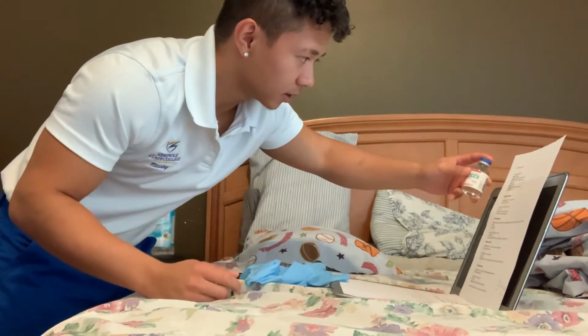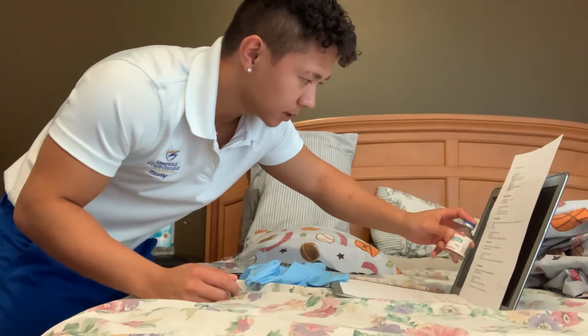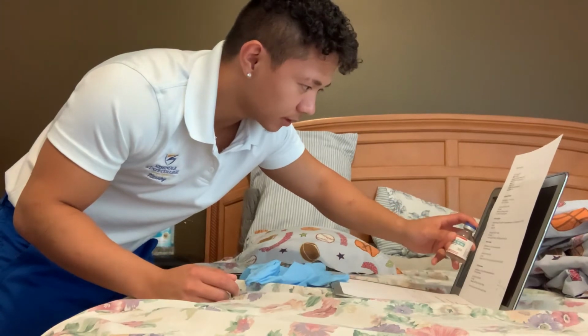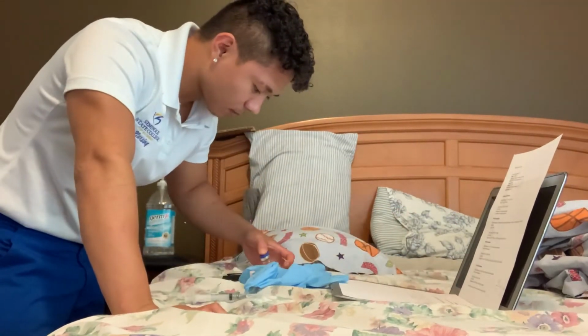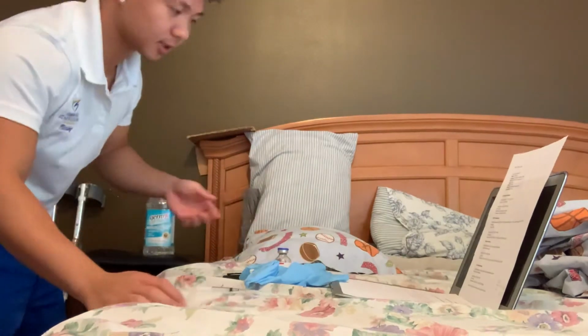So Anna Pawlowski, right patient, drug, influenza vaccine, dose, 0.5 milliliters, intramuscular at 14:58, and have the right documentation. So they're both good. And now I've done that, I'm going to sanitize again.